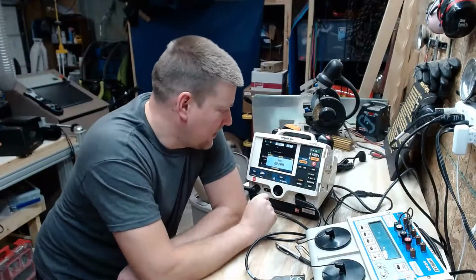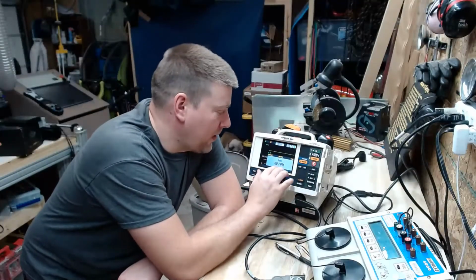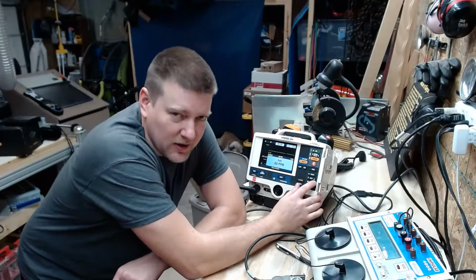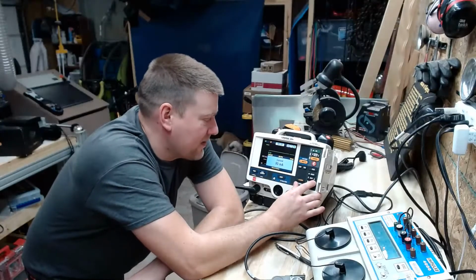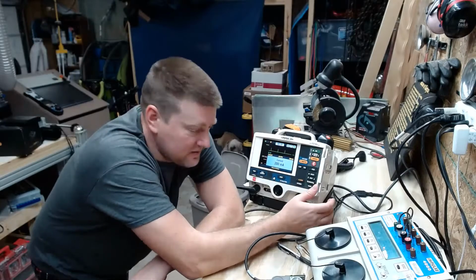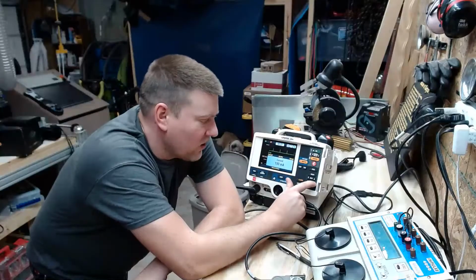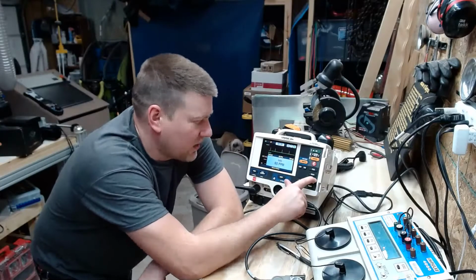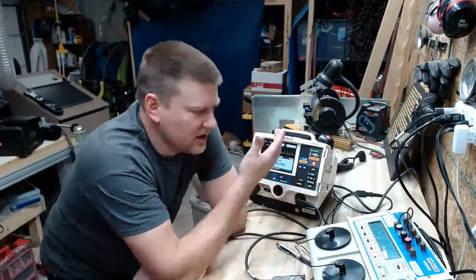Push analyze. You can see it defaults to 60 pulses per minute. That's the ppm. And you also set the current. So you can crank the current way up, and this is a pretty powerful pulse. 200 milliamps. When I test these things out, I run it all the way up, and I run the rate all the way up. It should be what, 180, 170.